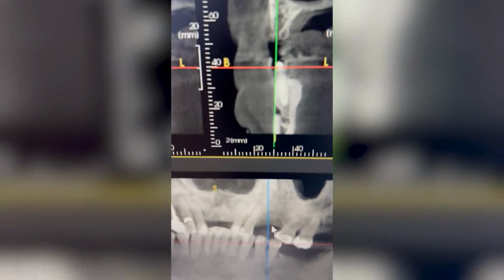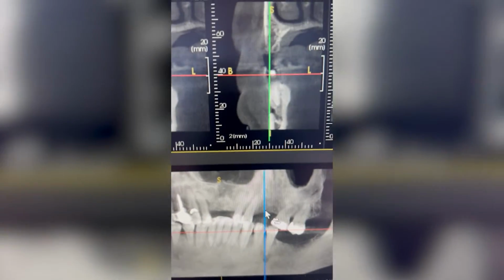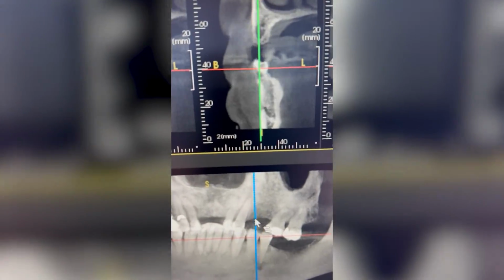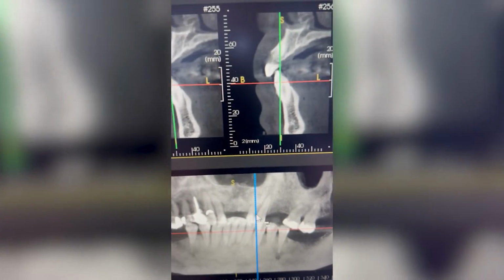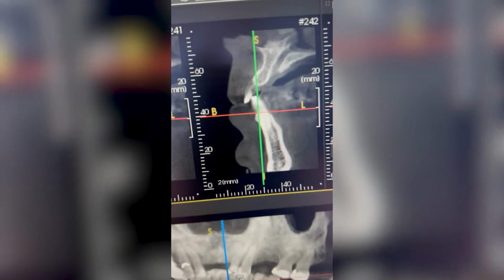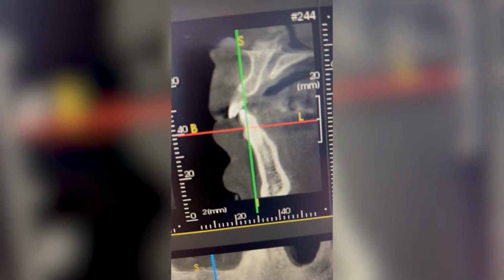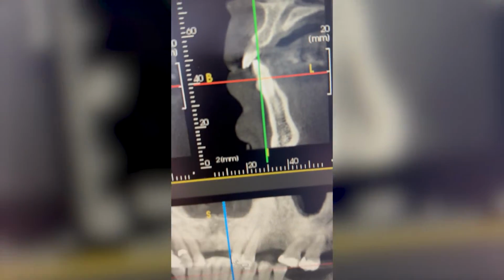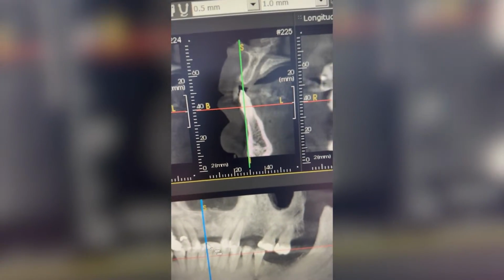And I chose to use the 3013 implants. And of course, this is our cone beam CT. And you can see I chose the 30 because the bone gets kind of narrow there at that indentation. So we're going to angle those implants in that direction and keep it between the buccal and lingual plate.